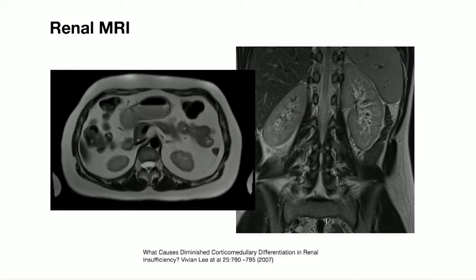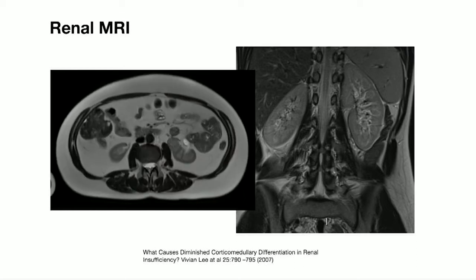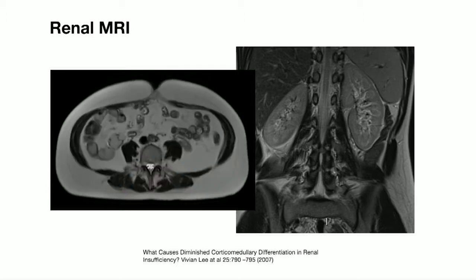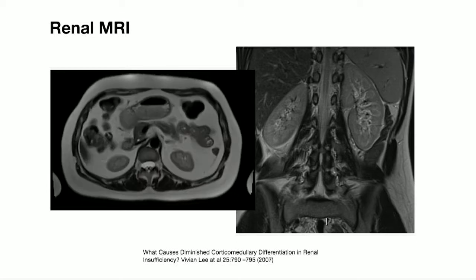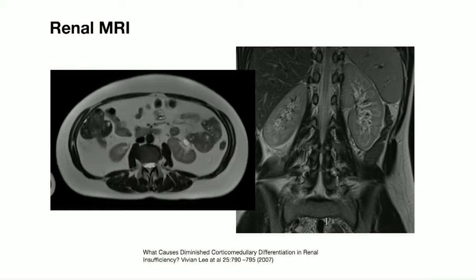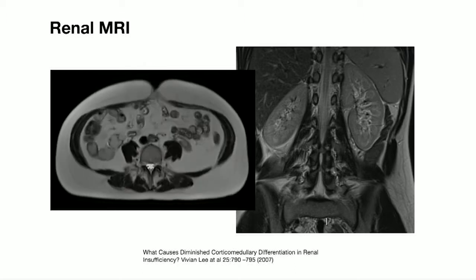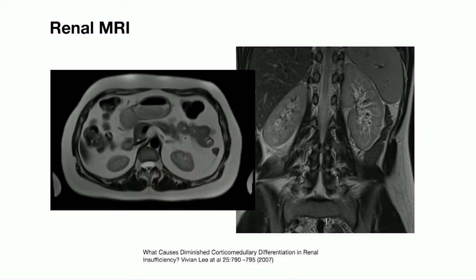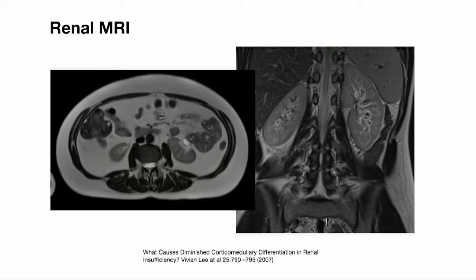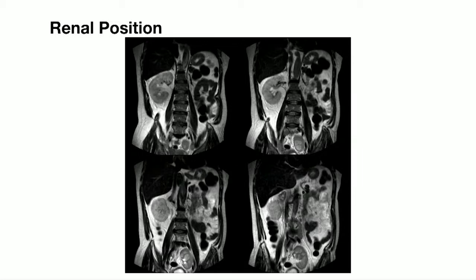And so if you're going to have a comprehensive protocol, we need to look at all the aspects of this, including just normal morphological imaging. We tend to use T2 fast spin echo type sequences, coronal or transverse, doesn't really matter which you use. And we can see nice corticomedullary differentiation on this. These look like nice healthy kidneys. And corticomedullary differentiation is shown to be a marker of nice normal healthy kidneys, as opposed to if we lose this corticomedullary differentiation, it's a sign of parenchymal disease.